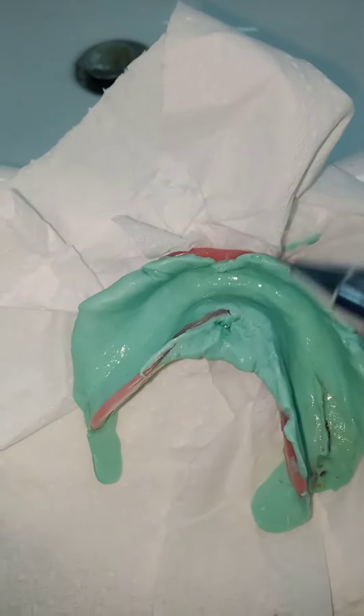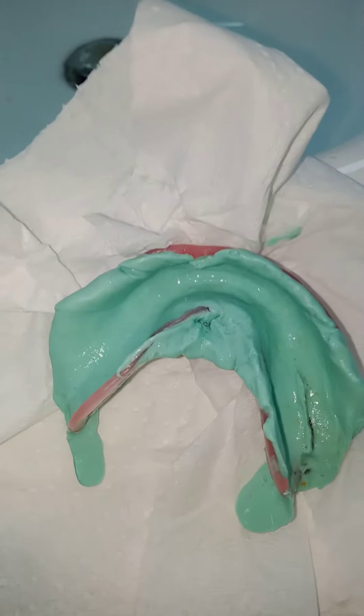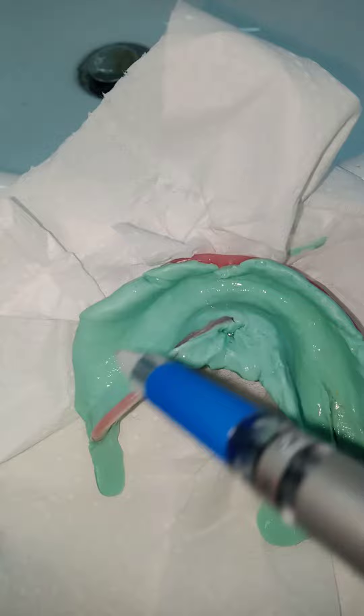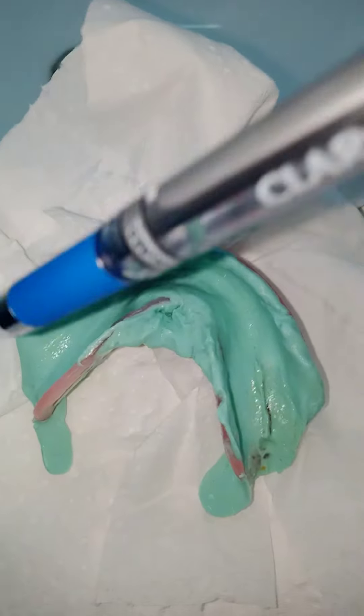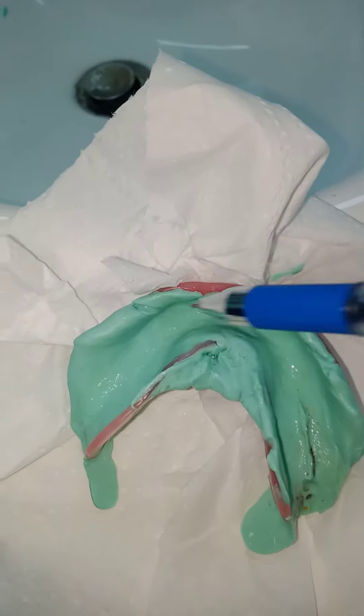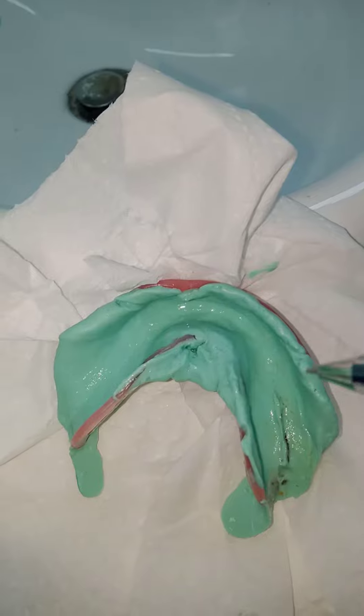But if your material was thin and you got this result, that means the denture is not seated. Because if it was seated, I should have this thinned out in the areas of primary support. Where are my areas of primary support? These are the buccal shelf area here, the buccal shelf areas here, and the slopes of the ridges. What I have is maladaptation.